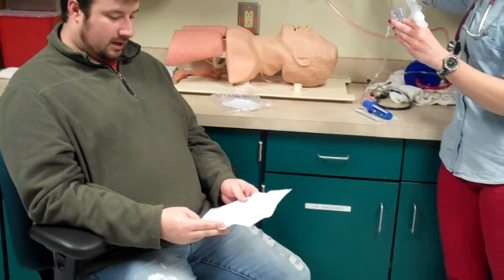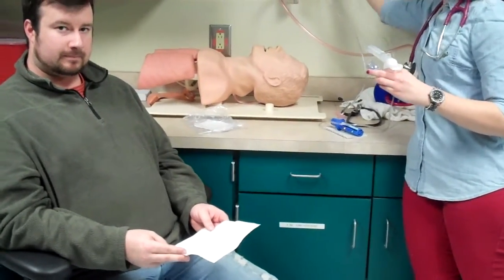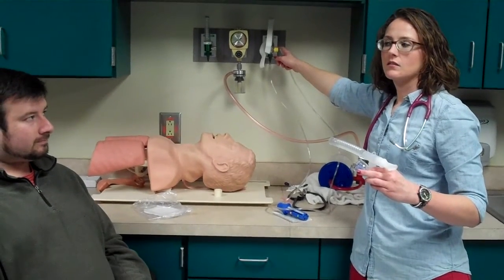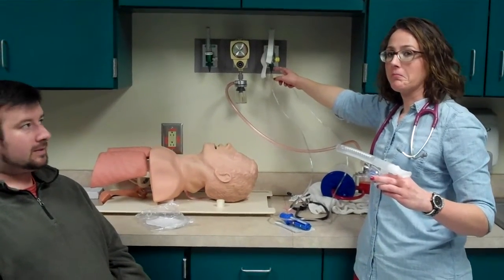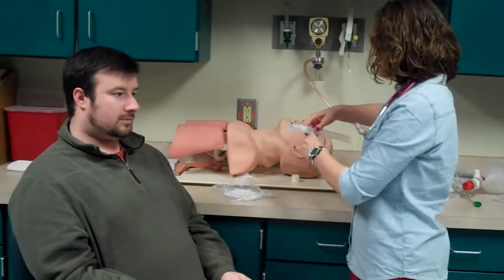And Daryl, inside that paper towel, what would you be looking for? The texture of the mucus or the sputum. Color of it. Victoria? Color, consistency. Taylor? Accumulation? Amount. Yeah. Consistency and amount. Alright.